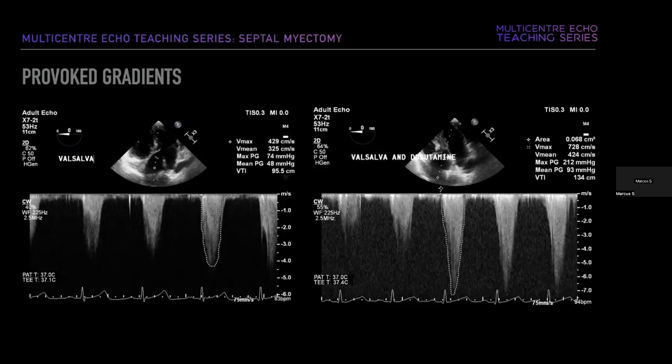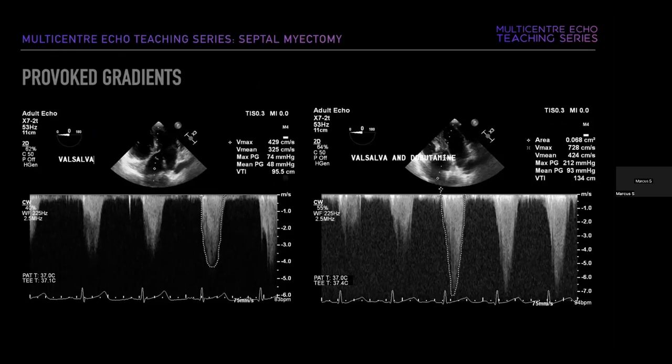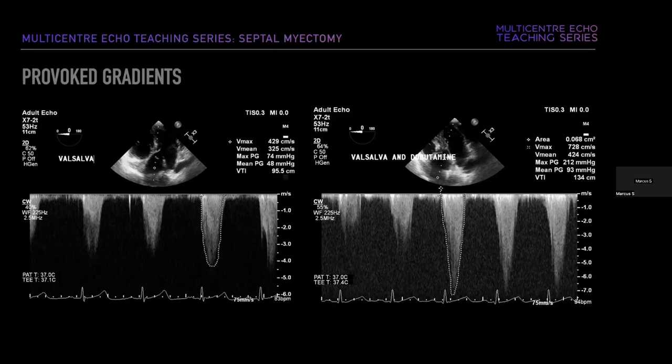Ideally during these surgeries, we wish to demonstrate a high baseline LVOT gradient that resolves in the post-pump study following myectomy. However, several hemodynamic changes under general anesthesia may diminish the LVOT gradient, such as reduced sympathetic tone, volume loading, bradycardia, and decreased myocardial contractility. In these cases, we often provoke gradients using Valsalva, myocardial irritation to induce PVCs, or dobutamine infusions.